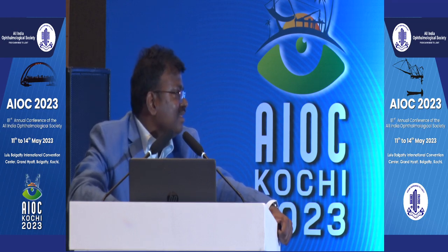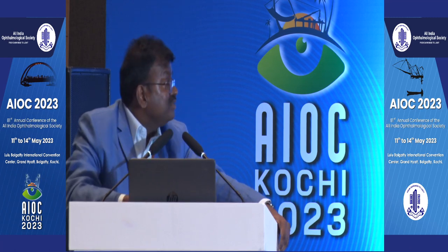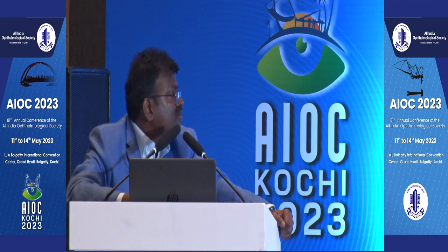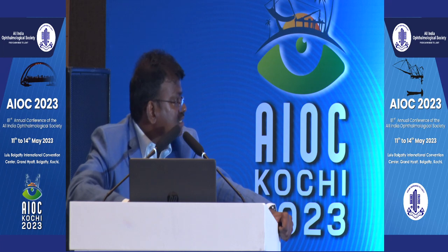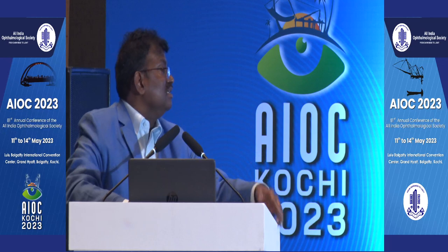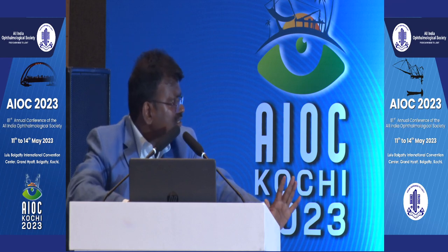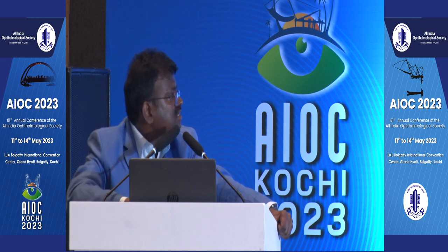And what about the risk of bleeds, choroidal bleeds? We have done a lot of cases. Actually, it is like draining subretinal fluid in the case of buckle surgery. If we avoid the 1, 5, 7, 11 clock hours, usually it doesn't bleed, number one. And in fact, that is the point of showing the second video, where you can visualize when we are entering. So you can see it's a smooth procedure, so no bleeding as such happens in these cases.